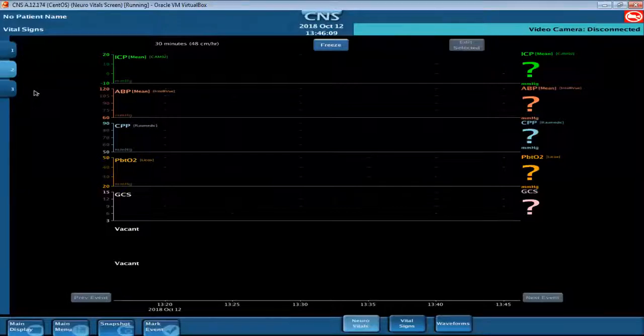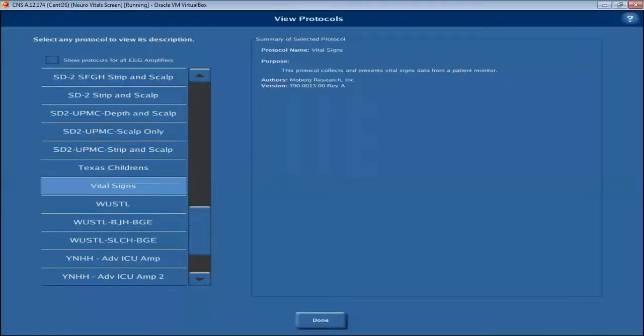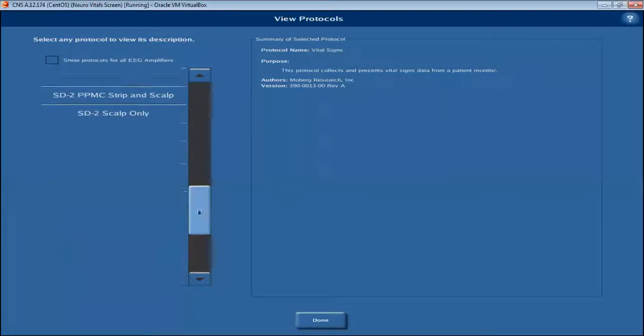Yeah, and for NICUs, if we were going to build a custom one, we would do it because we typically are only doing limited channel EEG in the NICU. And for neonatal, there's a bicentral biparietal option, and we would choose that for NICU as a base. Let me see if I can show you the difference in what that looks like.